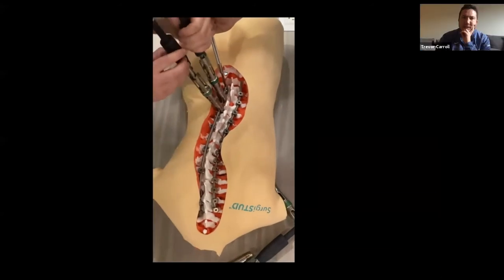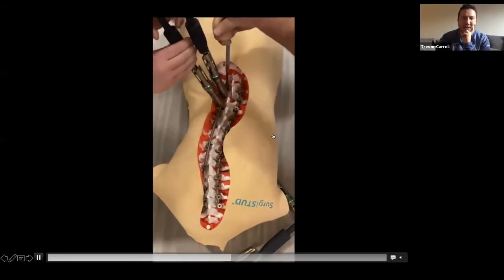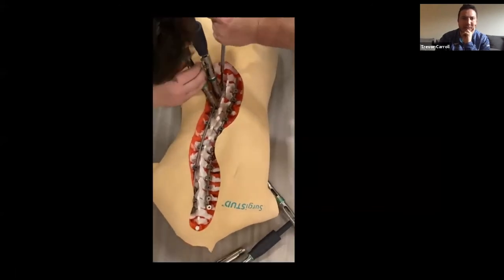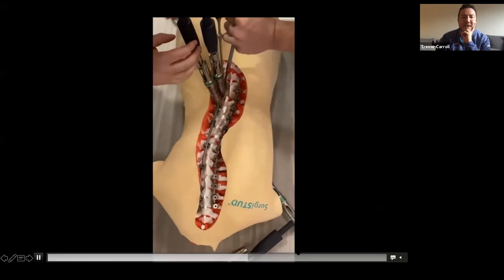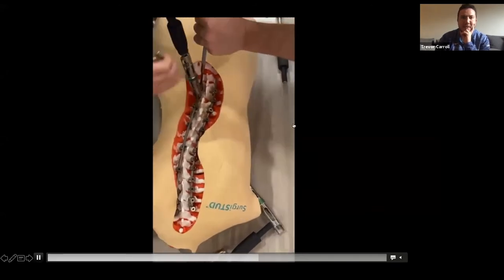Yeah. And then, being mindful of where the wrench is, you made it a lot easier by lining up all the screws over the rod. So look, this video is about half as long as the other one, just because it's faster to do.